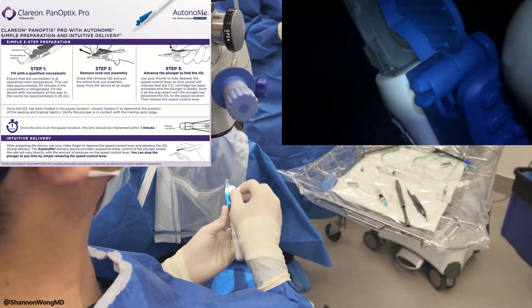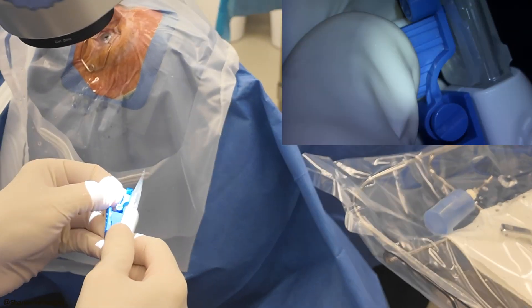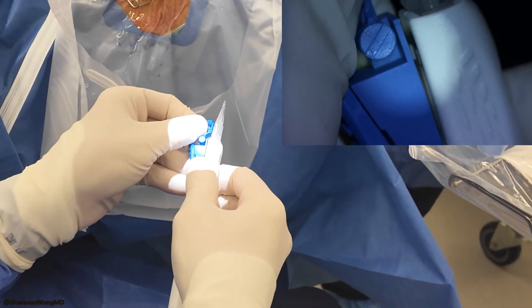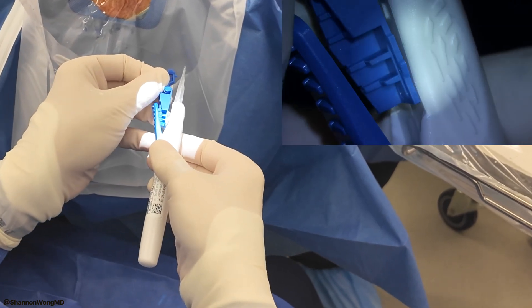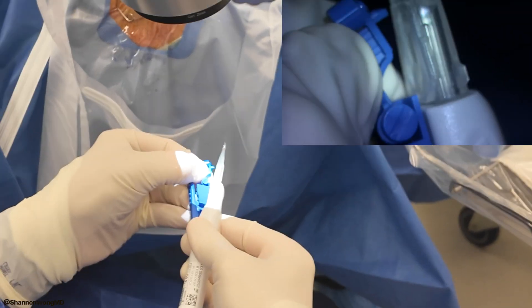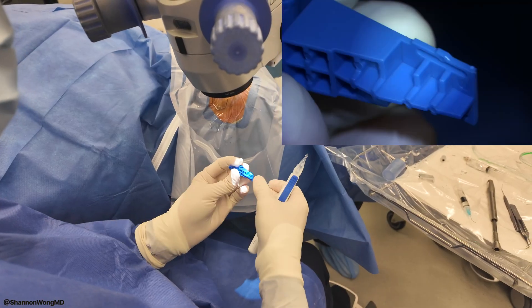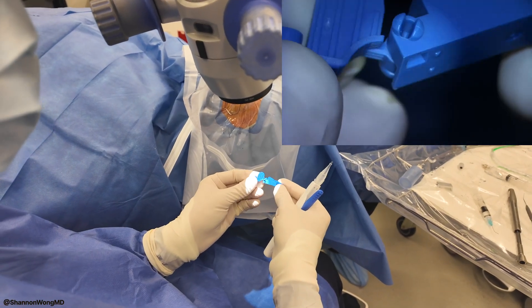Now we're supposed to remove this tab. So you can get a zoom in on that. I'm just going to pull and then pull the whole thing out. So let's look at how that goes in — and this goes in here, that's how it comes in, and this is how it comes out. So this is consumable. It's like a Lego piece.